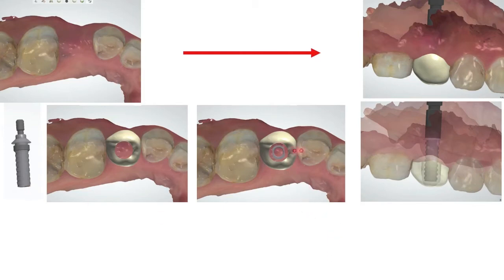Right there, okay, here you see the provisional component. Here you see it occlusal. You'll see this space. Space is built in, so when the implant is placed in that position, the provisional is just going to slide into place. I'd rather spend an extra 3, 4, 5 minutes putting in a little more acrylic than spend 10 or 15 minutes trying to get something to fit.